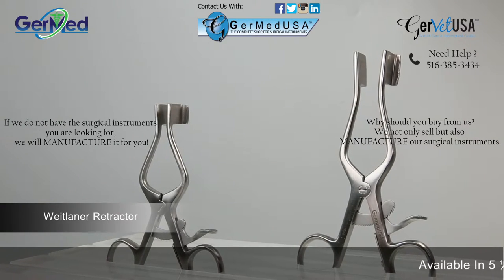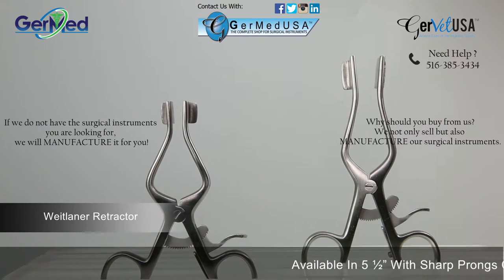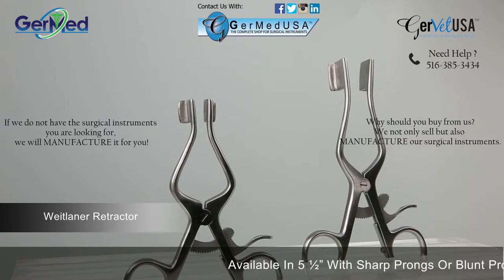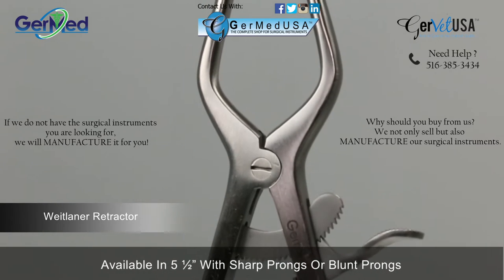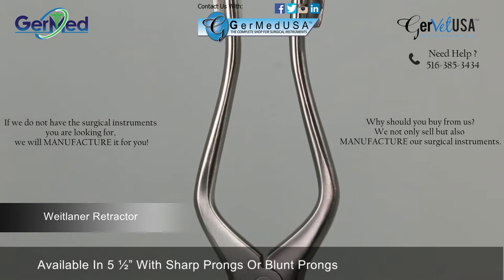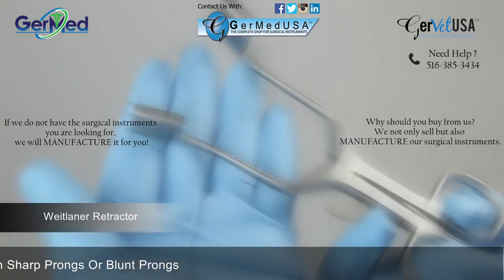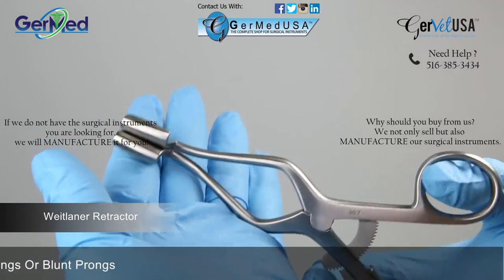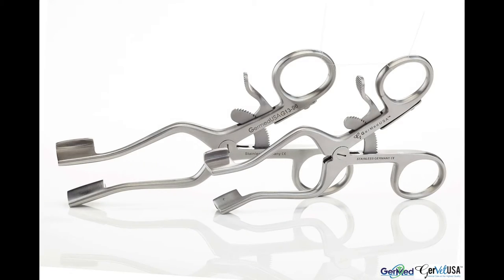GerMed provides Weitlaner retractors in sizes 4 1/2 and 5 1/2 inches. A Weitlaner retractor is a self-retaining finger ring instrument used for holding back tissue and exposing a surgical site on small surgeries. The retractors feature a solid blade.